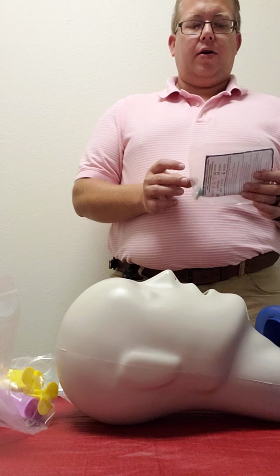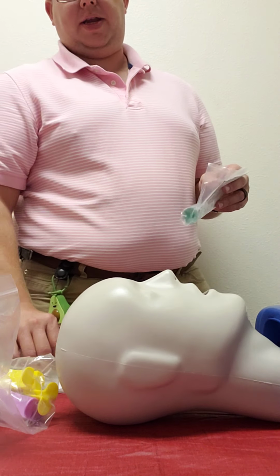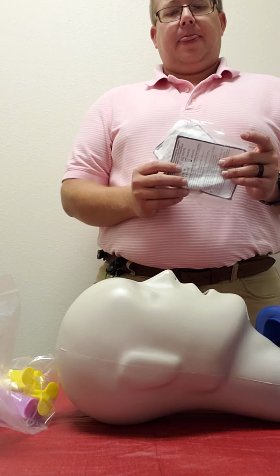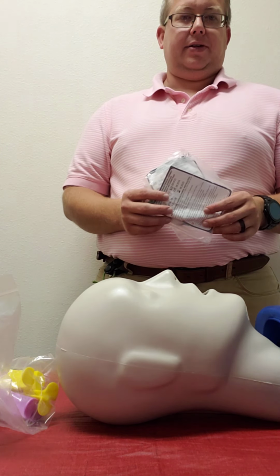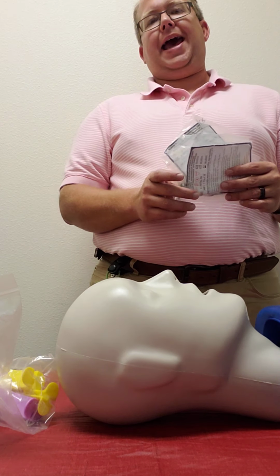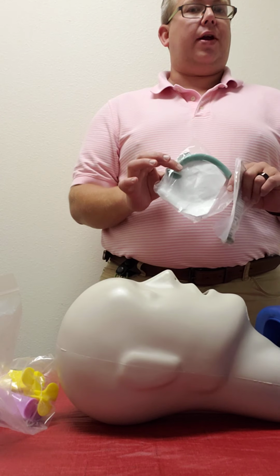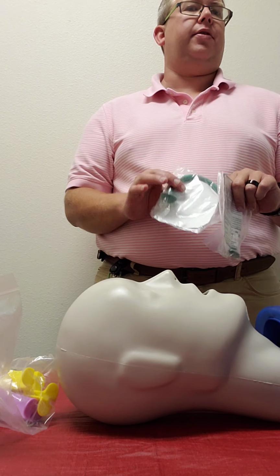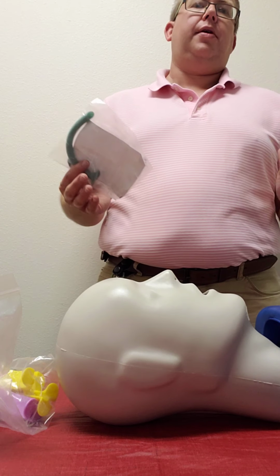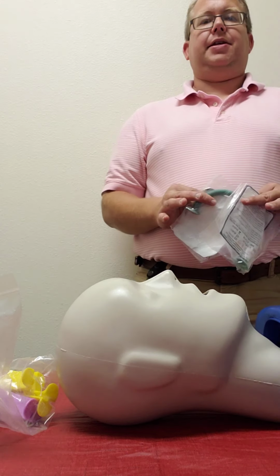So, what we want to do is select which one is appropriate. Now, which one is appropriate? In order to determine that, we need to find out if the patient has a gag reflex. If the patient has a gag reflex, then we're going to go with NPA. And NPAs are great because you can put NPAs in at any time. They can stay in even when the patient's awake. You don't even have to worry about taking them out. They may be uncomfortable when they wake up, but they can stay in.